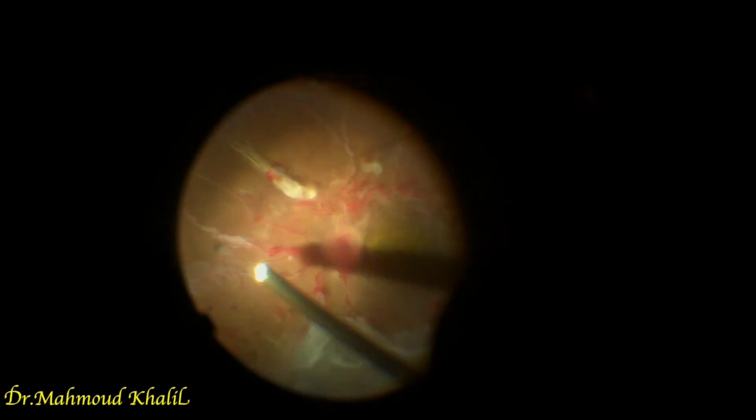The trick in this case is to cut all of the bridges. Any peripheral attachments of the membranes have to be removed before attacking the epicenters. When the epicenters are free from any peripheral attachments, then it is easier to remove them with delamination.